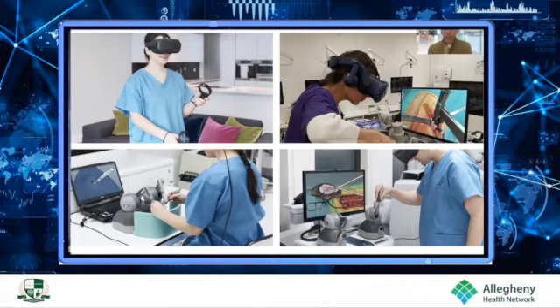On the right-hand side and along the bottom, you see tethered VR, which is where we're using a PC or a laptop to power the graphics and the interaction, and also the haptics. Much higher fidelity both in visual and haptic interaction. And of course, technology is advancing fast, so we'll continue to reduce the requirements for external processing and move everything into a standalone space over time.